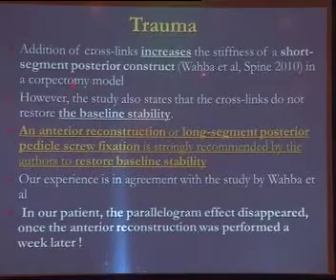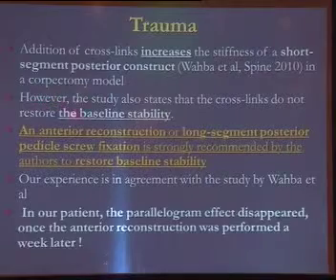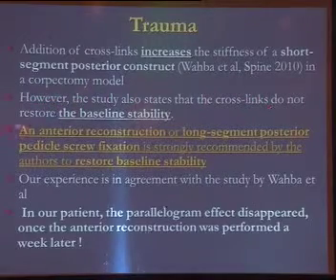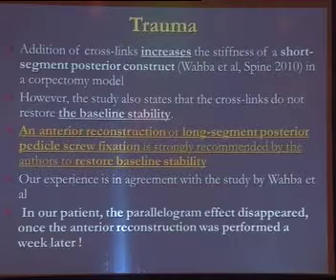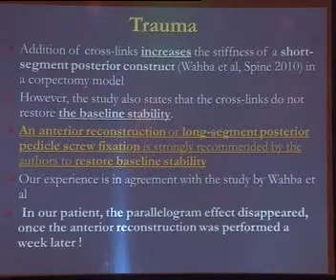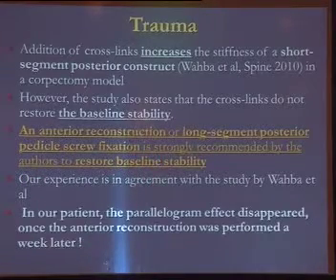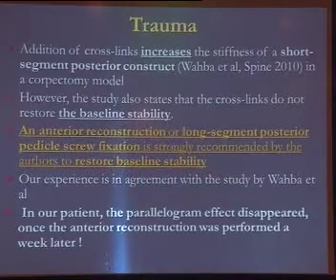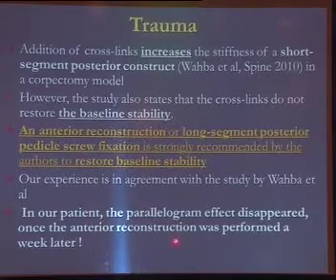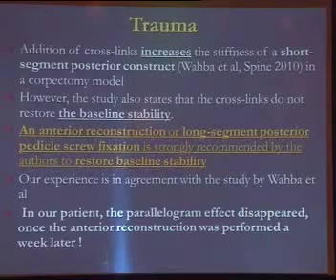Addition of crosslinks increases the stiffness of a short segment posterior construct in a corpectomy model. However, the study also states that crosslinks do not restore baseline stability, and anterior reconstruction or long posterior pedicle screw fixation is strongly recommended by the authors to restore baseline stability. Our experience is in agreement with this particular study. In our patient, you see the parallelogram effect disappeared once the anterior reconstruction was performed a week later.